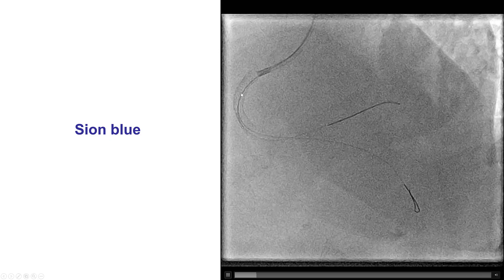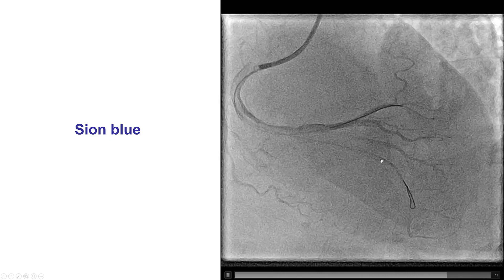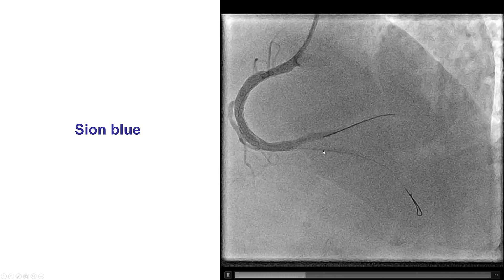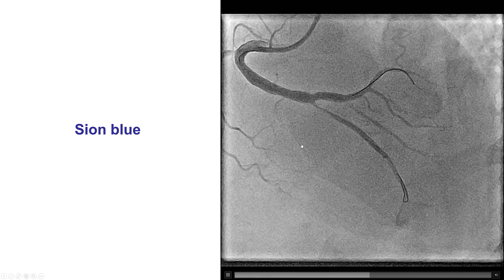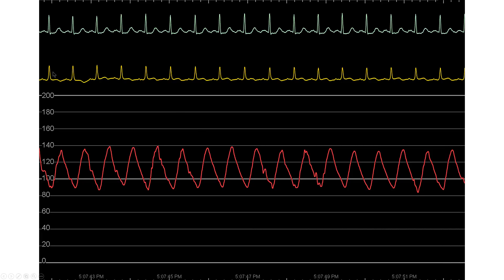However, the wire accidentally went into this large branch, which is actually the right posterior descending artery, that was completely occluded at its ostium. Immediately after we crossed through, there was restoration of antegrade flow, and there was resolution of ST-segment elevation and the reciprocal changes, as well as relief of the patient's chest discomfort.